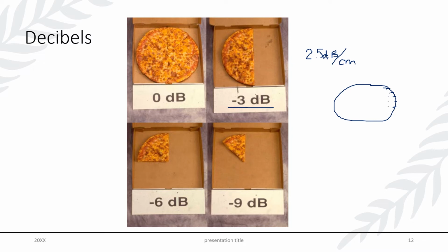And that's a good demonstration of how your sound gets eaten up so quickly, especially in your thicker patients, and why, for example, if we're using that 12 megahertz linear probe, which would result in a 6 decibel per centimeter reduction, we would lose 75% of our intensity after every single centimeter. We'd remove 75% here, another 75% there, and so on and so forth. So this is just a good example of why that theory we're taught, that higher frequency means lower penetration, is so important in your scanning.